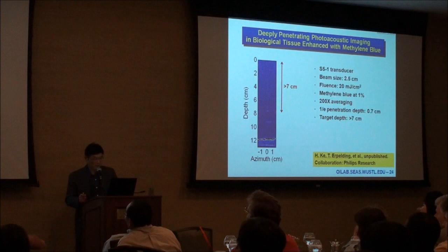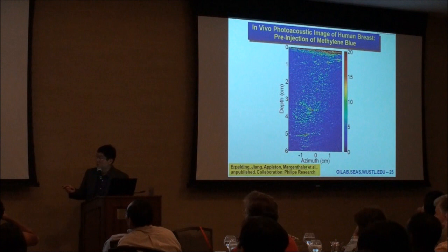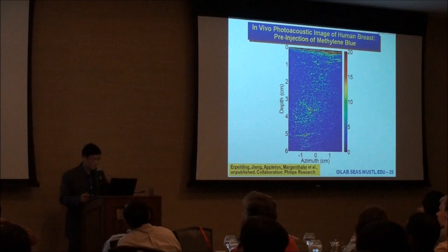Very recently we started clinical imaging using this technology, and we're very excited to see that even at a depth of 6 centimeters, we can still see features. This is in a human in vivo. And we're doing more studies trying to figure out what these features represent.